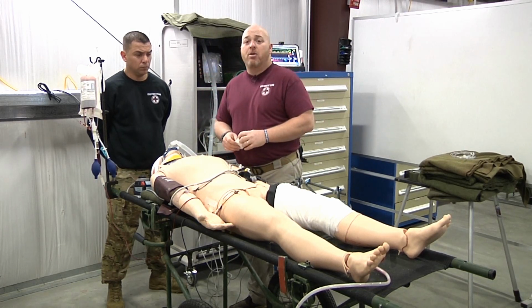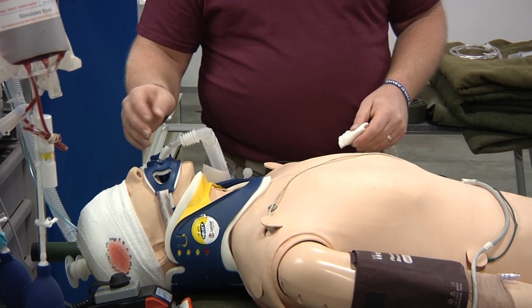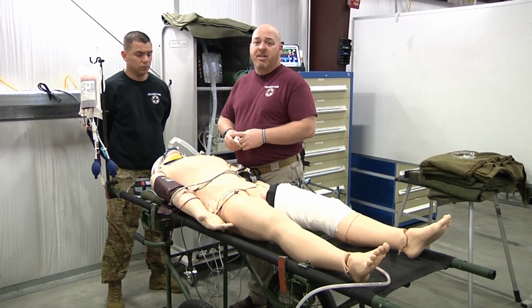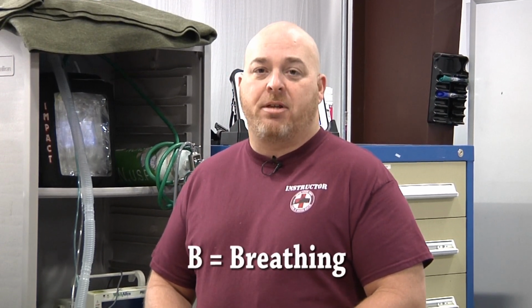Finally, last thing we want to do is we want to check the chest x-ray. All right. We know that we have good end-tidal CO2. We know that we have proper placement depth. We've secured it. Just verification via chest x-ray is the most definitive way to confirm airway placement. Now that we've talked about H for hemorrhage and A for airway, we're going to discuss B for breathing.